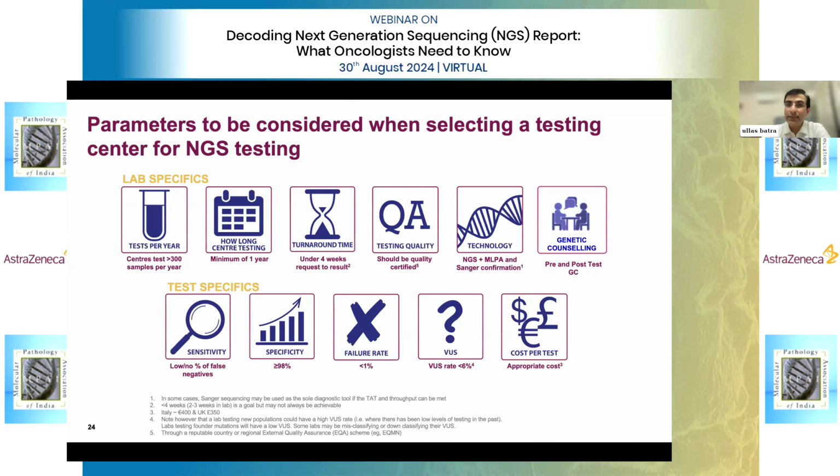And since we have only 1 or 2 minutes, what is the concordance rate if I send a half sample to you and half to Dr. Suruchi and half I keep with me? How much is the concordance between all the labs? I think 100% it should match, unless there are technical issues. Feroz is absolutely politically correct today.